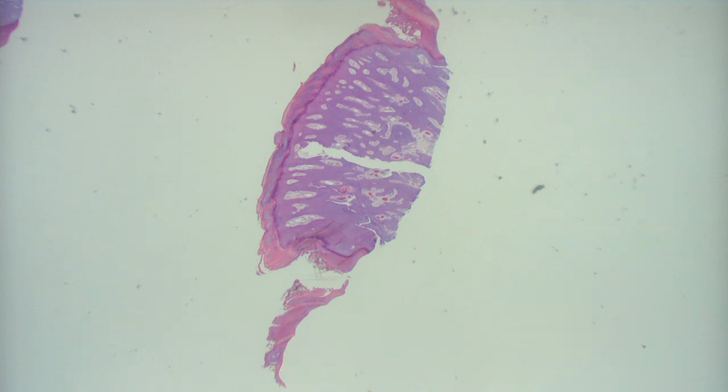So you see them kind of going in, solid, these uniform blue cells, like a nevocellular type. So you think it's an inflammatory or neoplastic process? I guess neoplastic. Neoplastic, good. And benign or malignant? Benign. Yeah, it's very symmetrical, very well circumscribed. You can actually see a little dell on both sides of this, like a little moat.